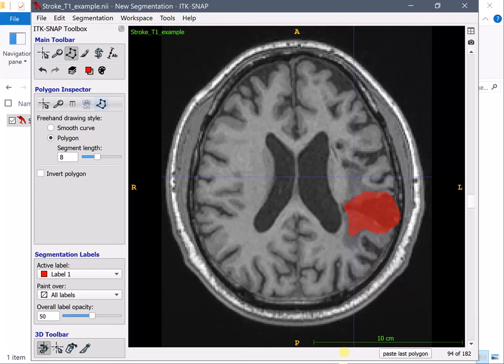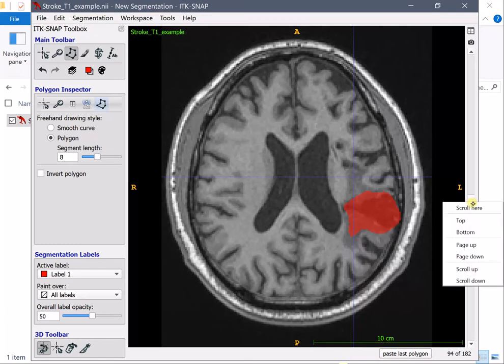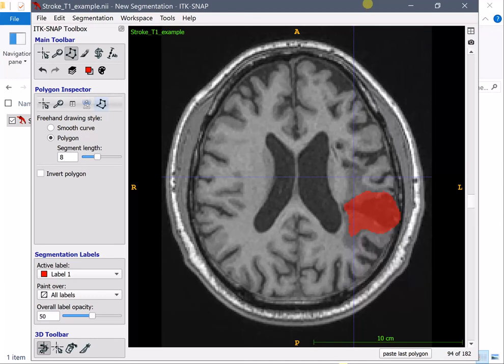Now here comes the interesting part of ITK SNAP which helps you segment the lesion much faster than before. Normally you draw the lesion on every slice and there can be hundreds of slices or if in the future the resolution of images get much better for example at 0.5 millimeters you would get more and more slices to draw.